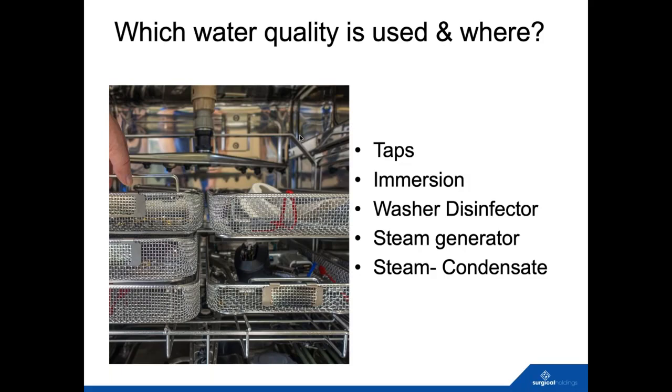Golly, water and steam of poor quality is just going to destroy your instruments, and you're going to wind up replacing and refurbishing instruments continually. So it's very, very important that folks have their water tested at their manual sinks, make sure that they've got good water feeding their ultrasonics, their washer disinfectors, and like you said, RO even feeding the steam system so they can take care of the instruments inside the sterilizer as well.